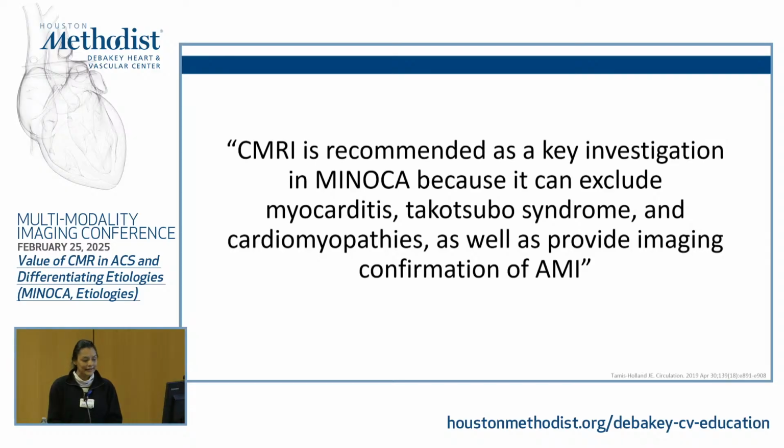So these guidelines say that basically CMR is recommended as a key investigation in MINOCA. The reason is that it can exclude syndromes like myocarditis and Takotsubo cardiomyopathy, but most importantly, it can determine the presence of an MI.